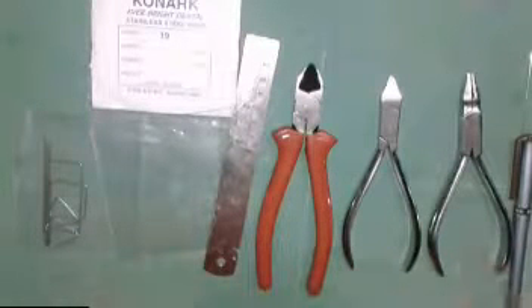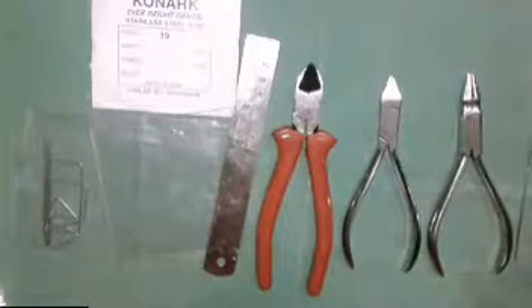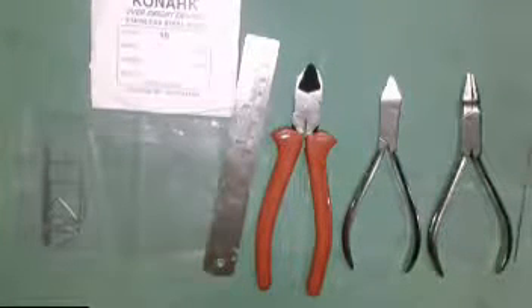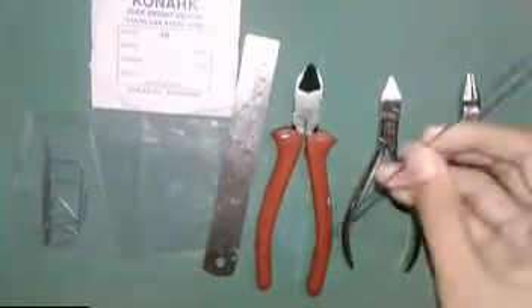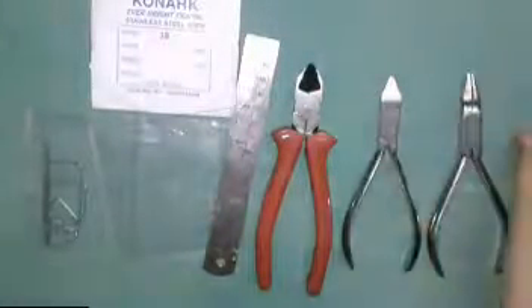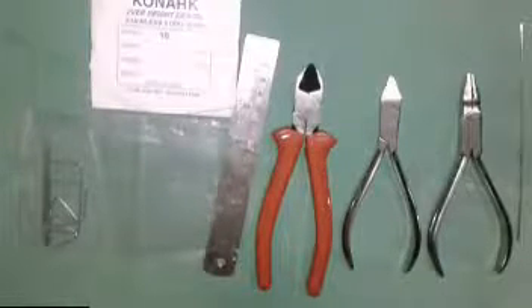Now I am showing the instruments required for orthodontic wire bending. First and foremost, what is needed is the orthodontic wire. This is an orthodontic wire. For basic wire bending, in the first exercises, we want to take a 19 size wire — this is a 19 size wire.